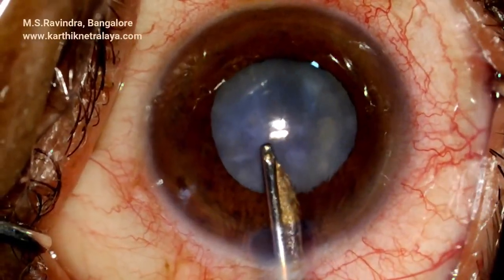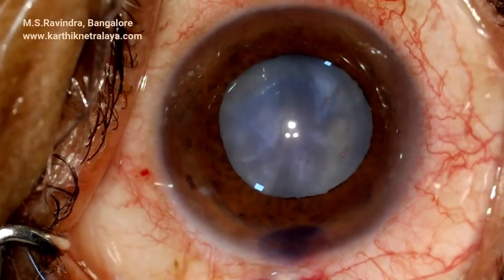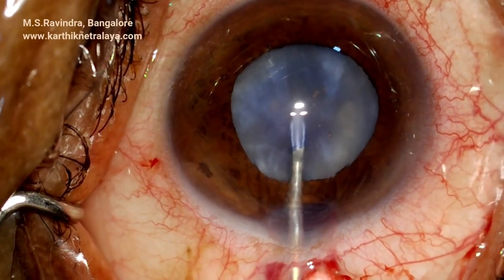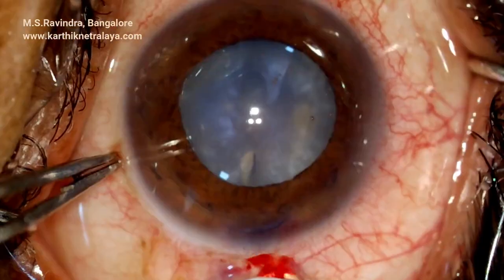Trypan blue staining is applied. The stain is aspirated with the Simcoe cannula, and the AC fills the eye. A 23 gauge needle aspirates the loose anterior cortex, and a blunt keratome enlarges the opening.